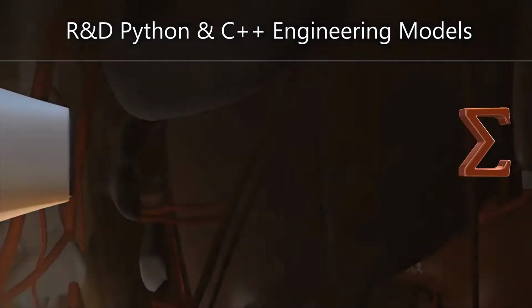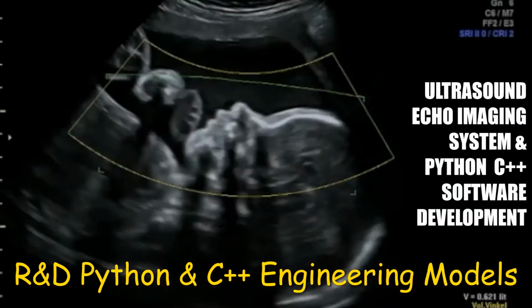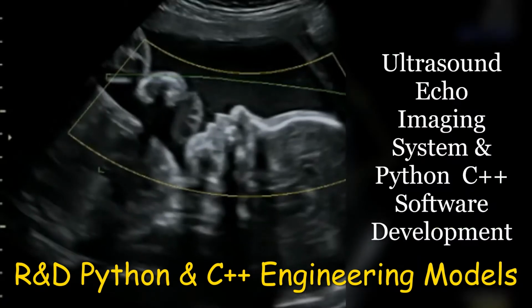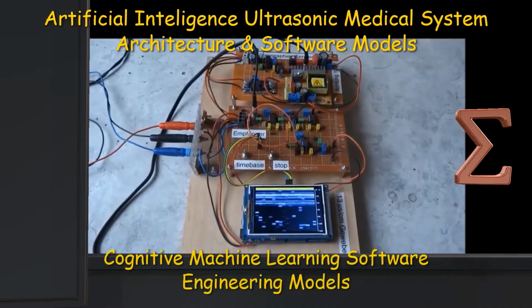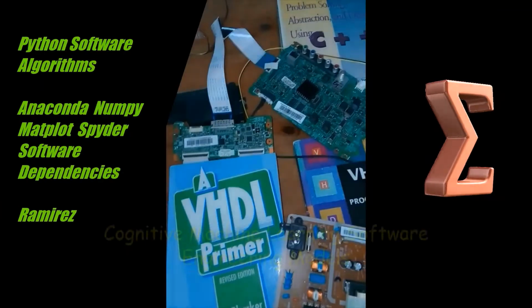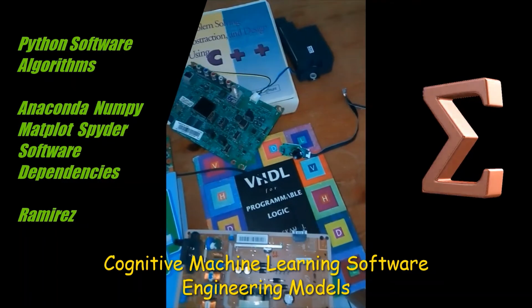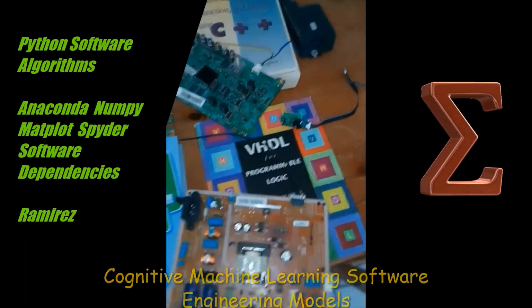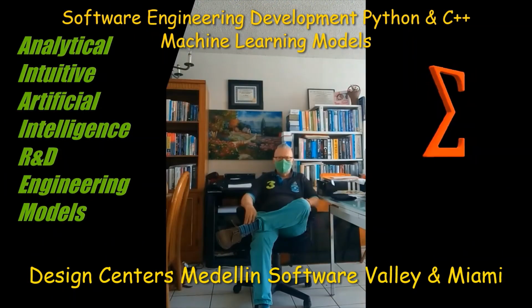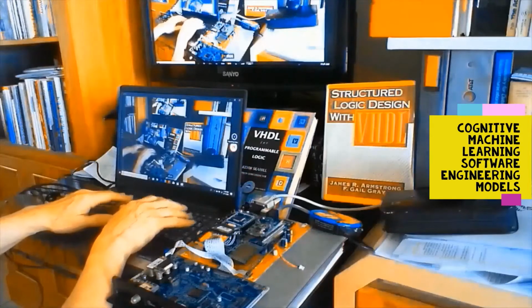The ultrasound waves are produced by a transducer, which can both emit ultrasound waves as well as detect the ultrasound echoes reflected back. In most cases, the active elements in ultrasound transducers are made of special ceramic crystal material known as piezoelectric.